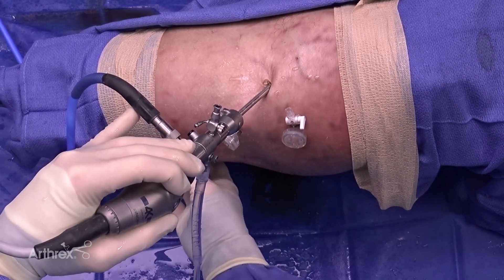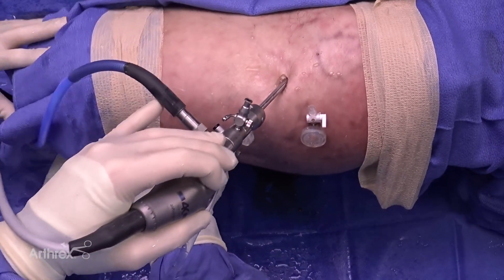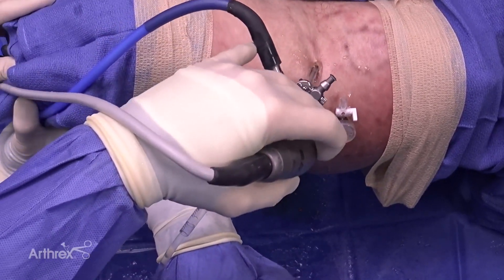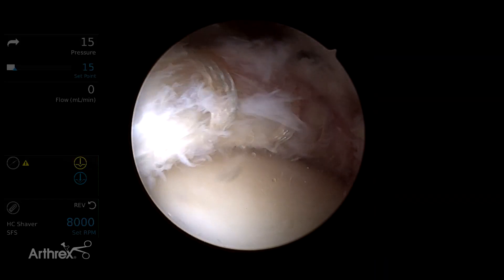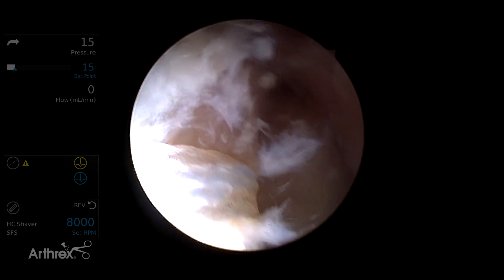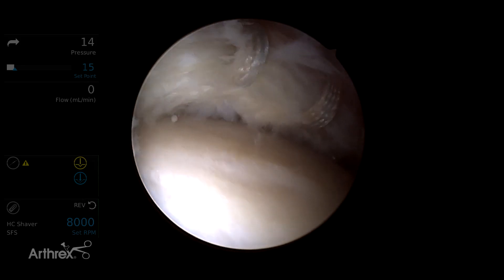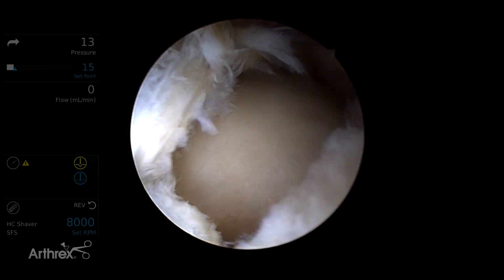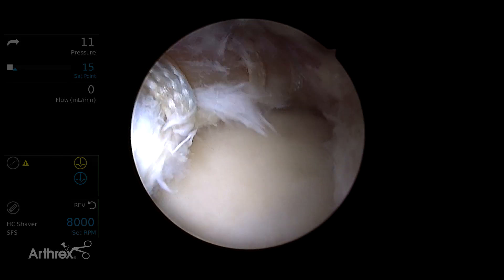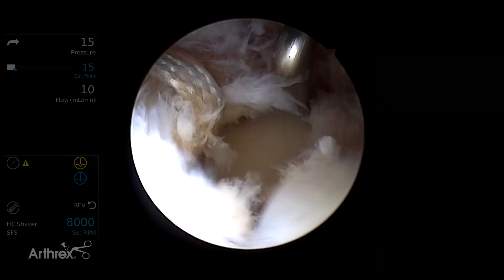Once the labral repair is completed, traction can then be removed and the hip can be flexed. The suction seal is restored. You can see the sutures have well repaired the labral tear, with adequate restoration of the entire suction seal from native labrum to native labrum with a complete repair of the labral tear.